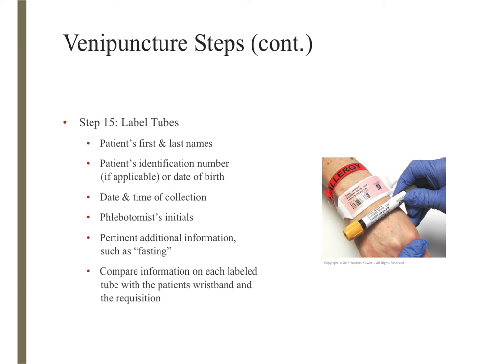If I don't have a requisition, if I'm just in a chair and I've got the tube and the patient and maybe the computer, I'm going to verify on the computer. I'm going to tell the patient, is this you? And I'm going to show them every tube, okay? If they are alert, that is great to do, because this is what happens.